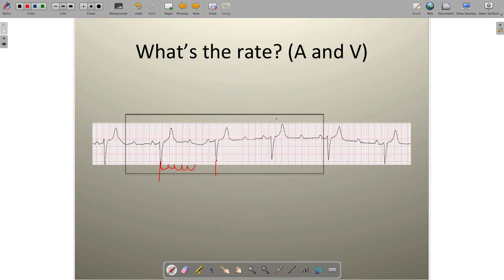All right, well, I see a box here. You won't always have a box in the field, of course, but you'll have these little hash marks at the top. These little hash marks will signify 3 seconds or 10 seconds. They'll be specific. I'll show you those in class. But these hash marks will mean something, and you won't need this black box anymore.